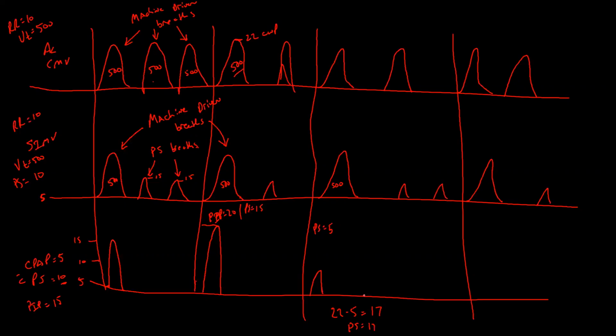And now when I give a breath, I'm at 5 already, and I come up to this part right here, which is 22 centimeters of water pressure. And there's a good chance that this is going to be roughly 500 cc's of volume. Okay. Does that make sense? No, that makes sense. Okay.